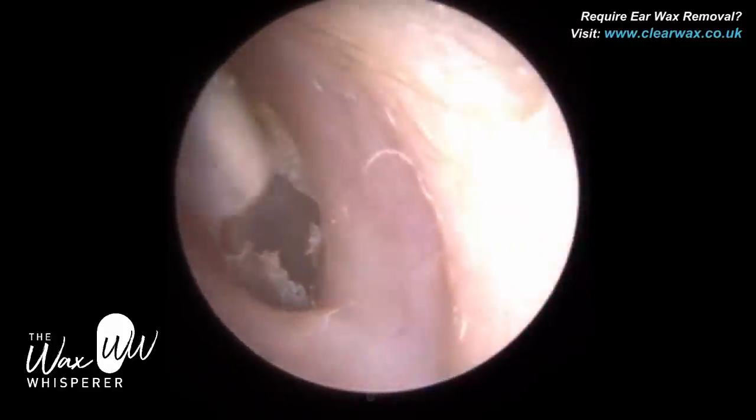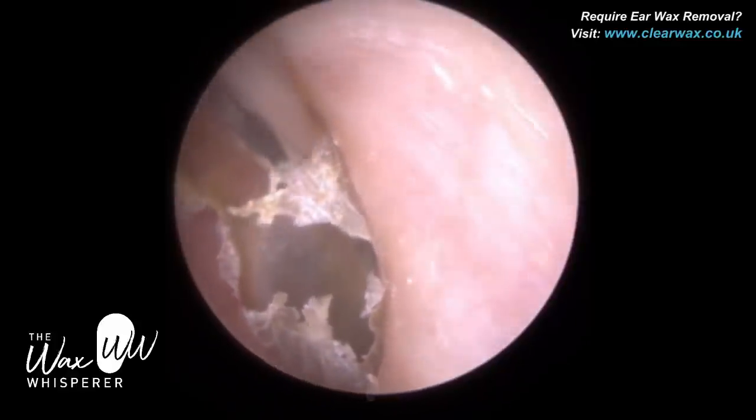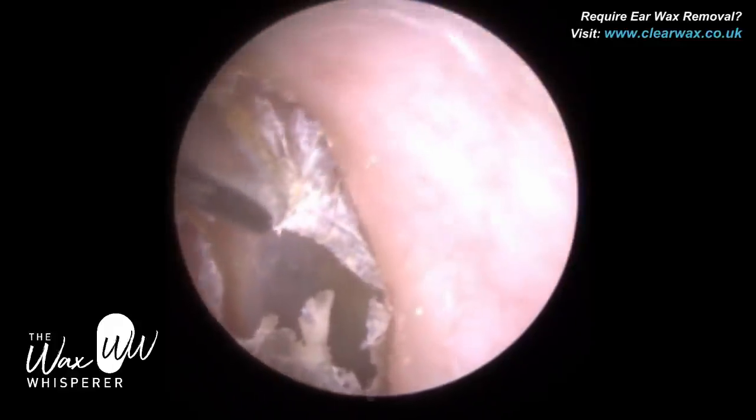This dead skin in the patient's ear, when it collects, it causes their hearing aid to feedback, to whistle, and the patient knows she needs to make an appointment.